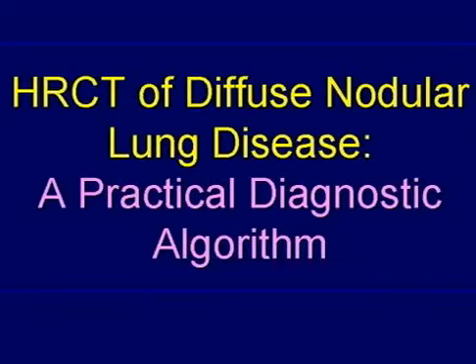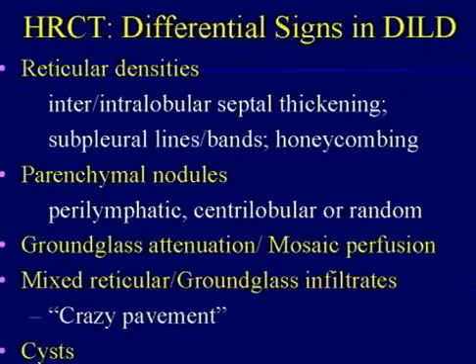Actually, the person who developed this initially was here earlier today, James Gruden. The idea would be to create some kind of algorithm. First of all, something I didn't get a chance to talk about, but I thought perhaps it would be worth just spending a second about, and that's how to scan people.